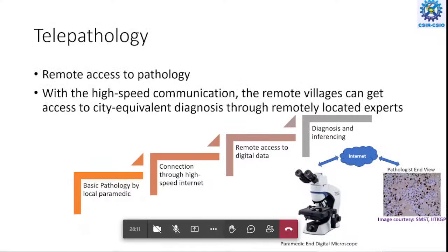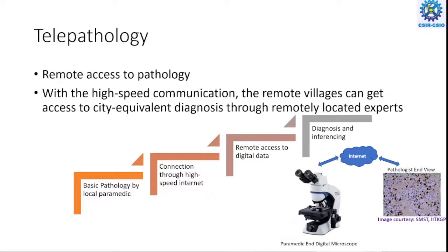There is another terminology called telepathology. Basically, what is happening here? We have the sample on the microscope, which is kept at one place, but the pathologist is sitting in another city. He or she can observe this sample under the microscope, sitting in his or her office at a remote location. Basically, it gives remote access to the microscope along with different controls.